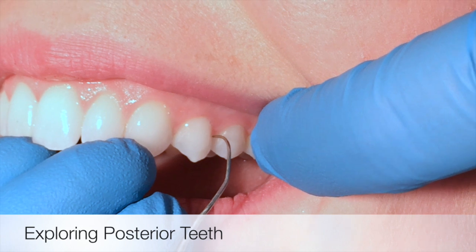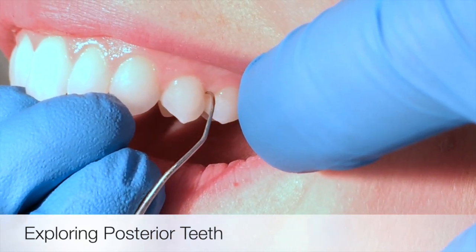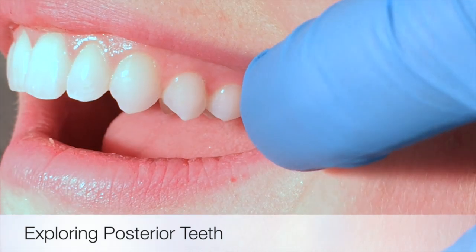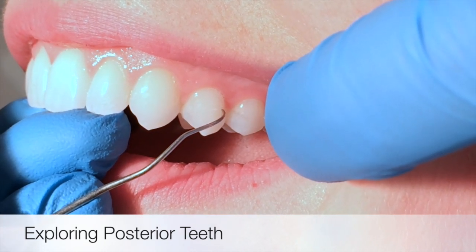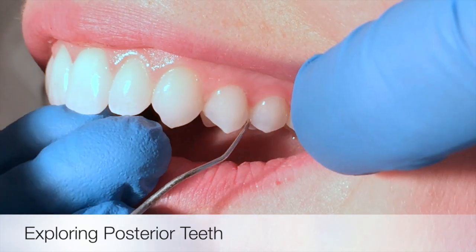For the posterior teeth, place an interproximal, and if that bend is pointing posterior for posterior teeth, it is the correct working end. Take a look if it was the wrong end — that elbow actually points anteriorly, which would indicate the incorrect end. This is correct.